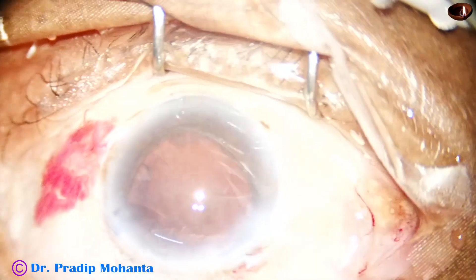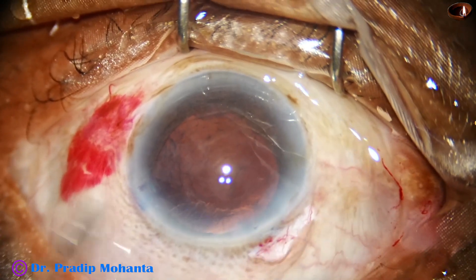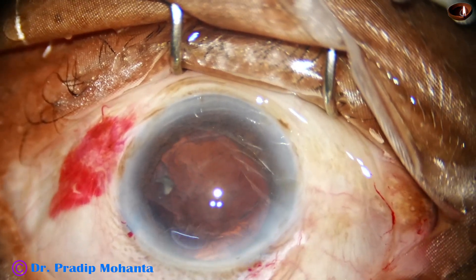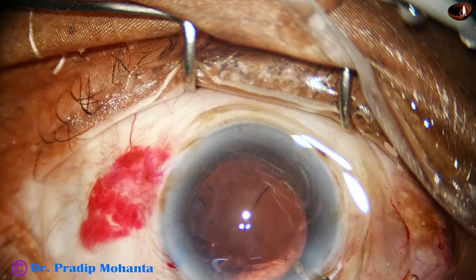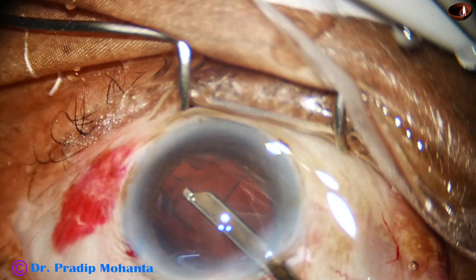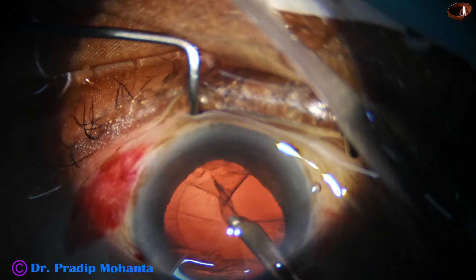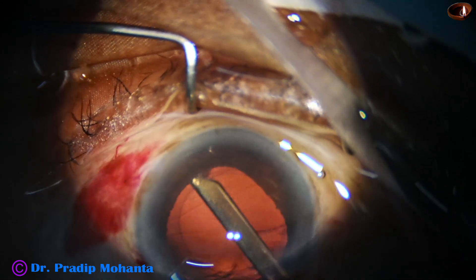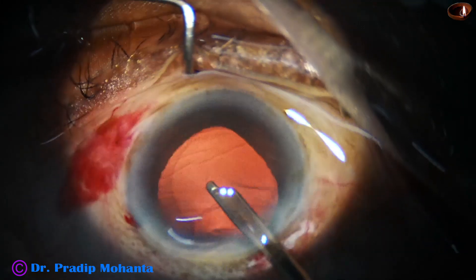Nucleus is managed. Now in this case there is some cortex and the cortex is firmly adhered to the capsule — strong capsulocortical adhesion. Before we remove the cortex, we must remove this small nuclear fragment. Engage it at the port and bring it out, and then start removing the cortex. The cortex is not coming easily; it is firmly attached to the posterior capsule — it is coming, but with a lot of resistance, as if it does not want to come. And now this is the last portion of the cortex.